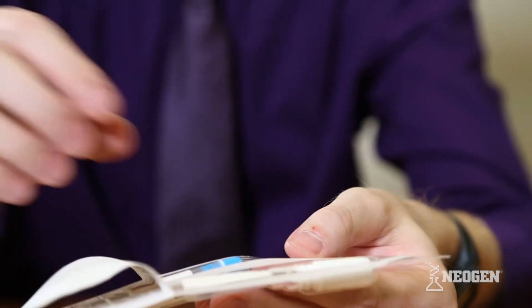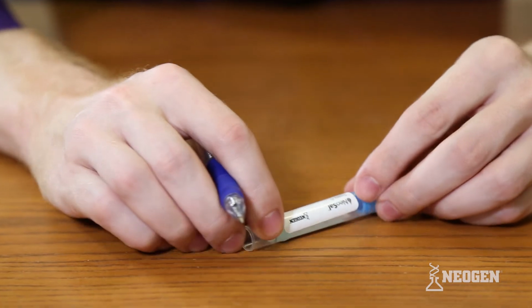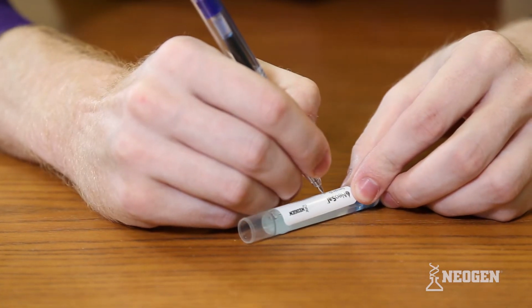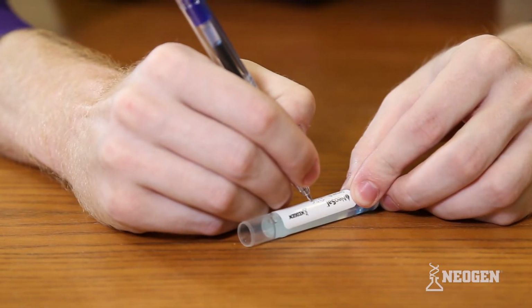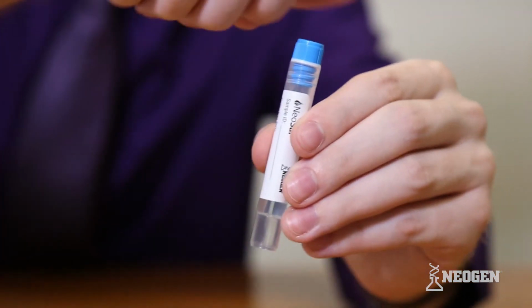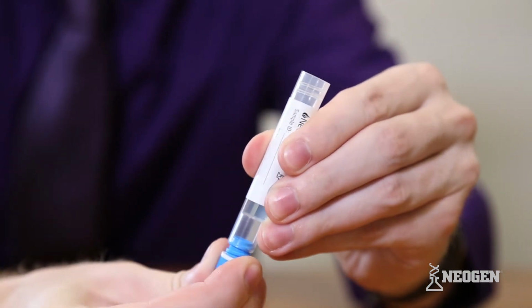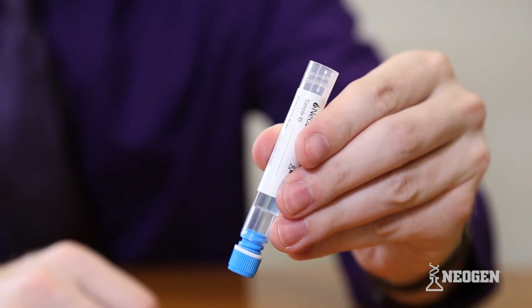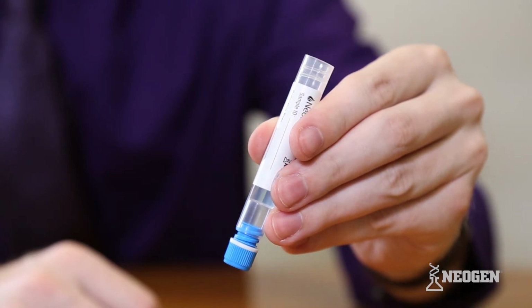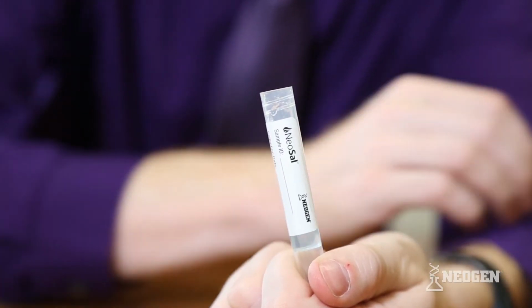8. While the NeoSal is in the donor's mouth, the donor should remove the buffer tube from the packaging, record donor information on the buffer tube label, or follow the donor identification and chain of custody procedures established by the testing laboratory. 9. While holding the buffer tube in an upright position, the donor should unscrew the blue cap to open and push the blue cap into the bottom of the buffer tube for storage. Do not discard the blue cap. The donor should be careful not to spill or remove the liquid from the buffer tube.